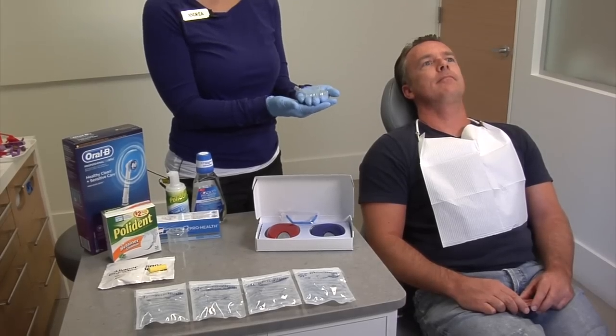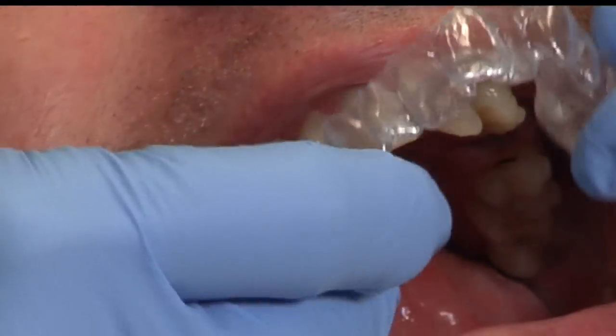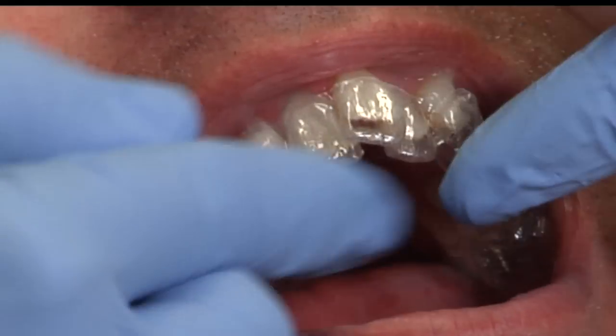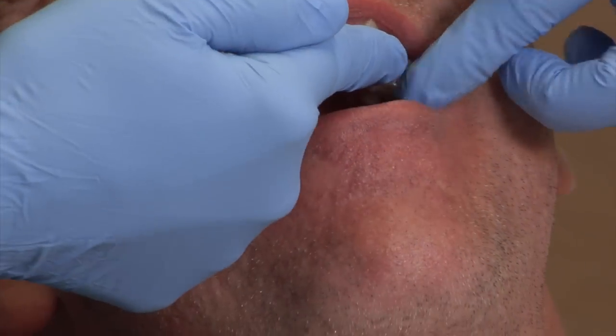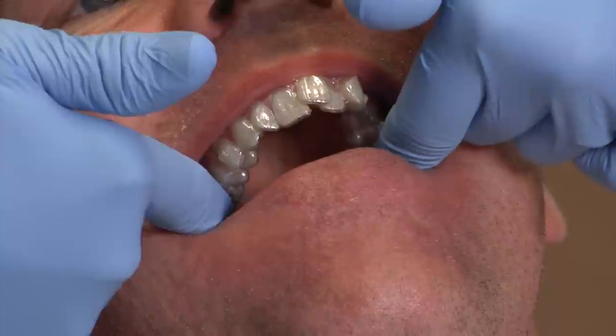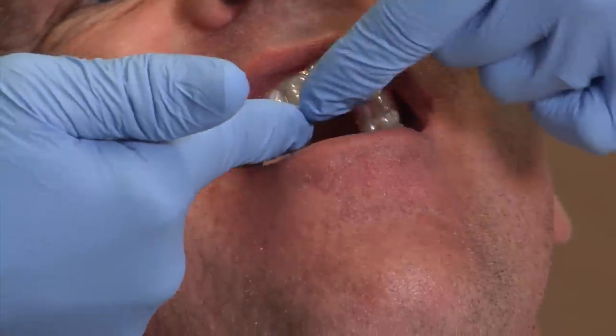We're going to insert the top aligner now. Just match it up and press everywhere on the biting surface of the teeth. Make sure to go all the way to the very back and press.